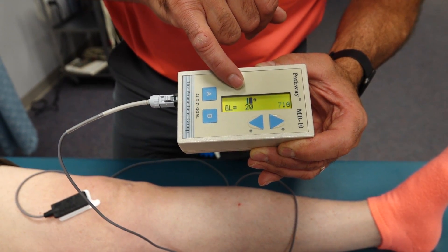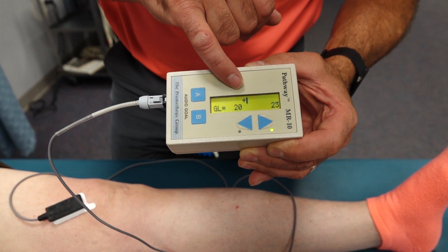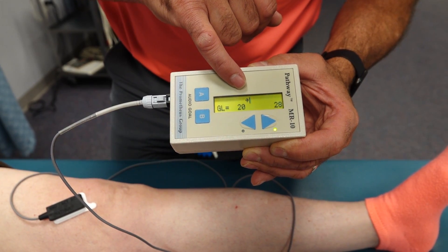So go ahead, Leslie, and tighten up your muscle. Tighten, tighten, tighten. And rest.